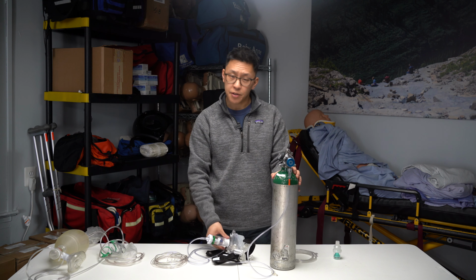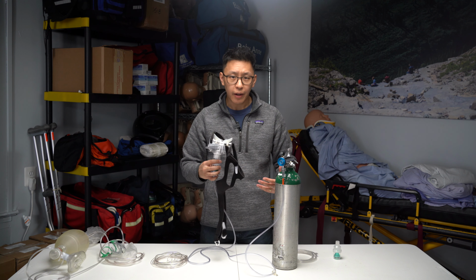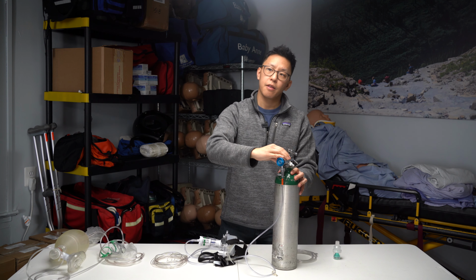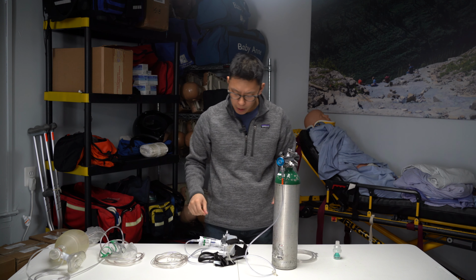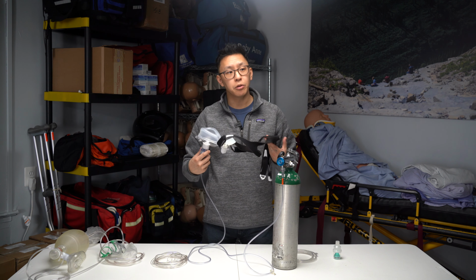Now, when I turn this on, it's going to be relatively loud. And if it's your patient's first time using this device, then they're going to be scared, frightened, overwhelmed, understandably so. If it's their second or third time using it, they're probably going to rip it out of your hands because they know how helpful it can be.